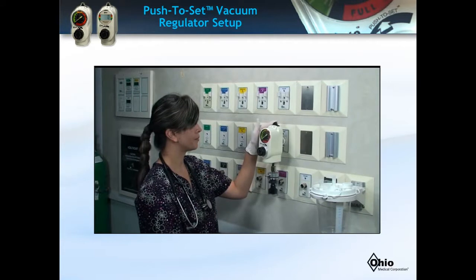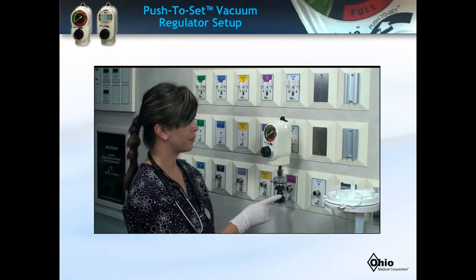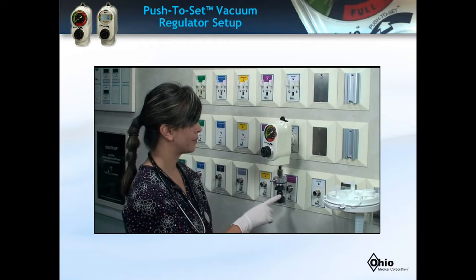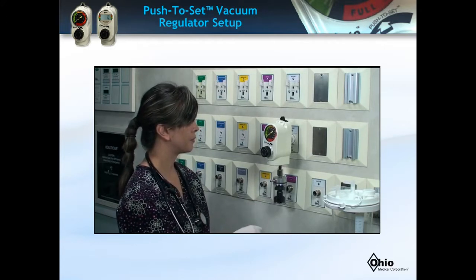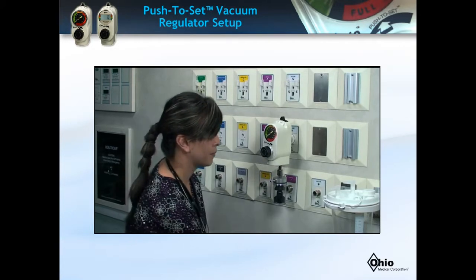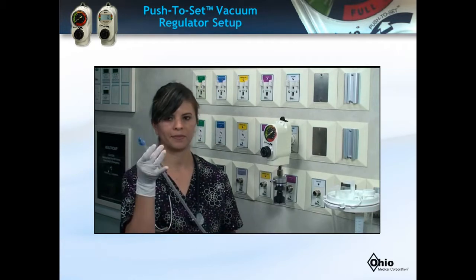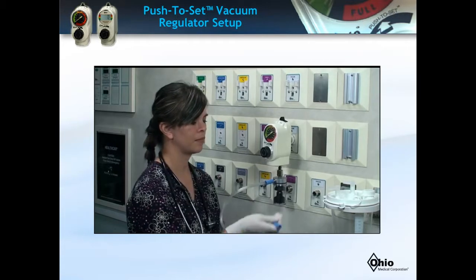Starting at the regulator, the National Fire Protection Association recommends an overflow safety trap as an insurance device to protect the regulator, wall outlet, and pipeline system from being contaminated. The trap is connected directly to the regulator. The recommended 18-inch in length by 1/4-inch diameter tubing is connected from the trap to the top of the suction canister vacuum port.